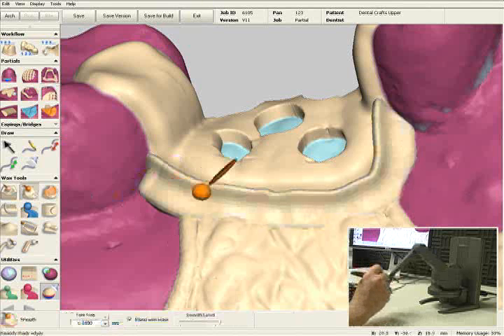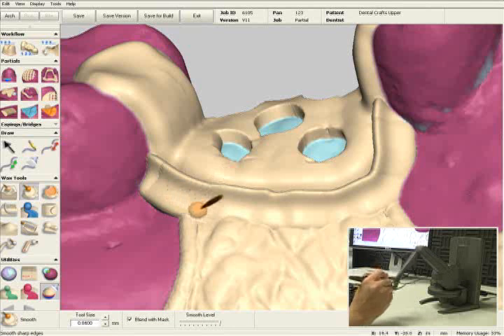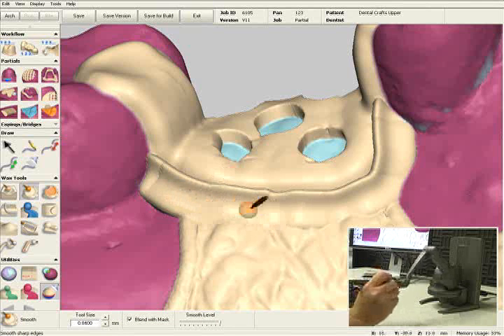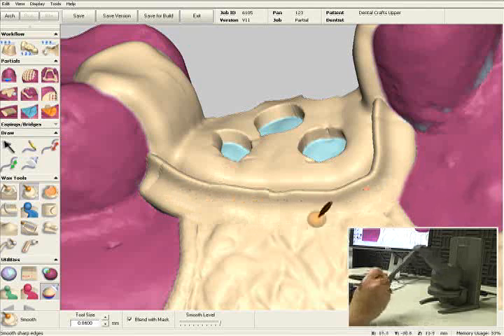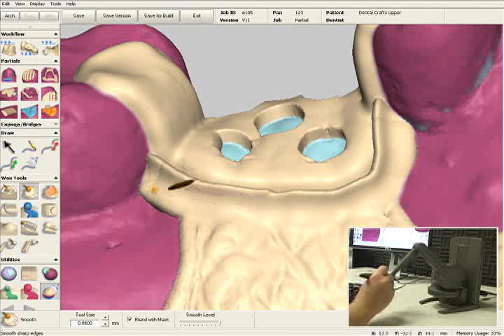I'll select the Smooth tool once again and blend this area in so it's nice and smooth with the major connector.